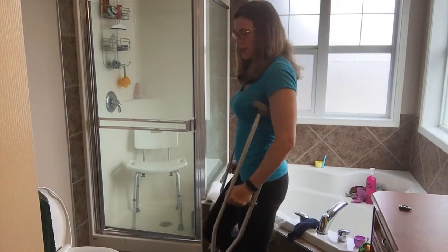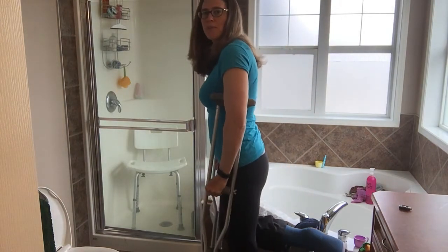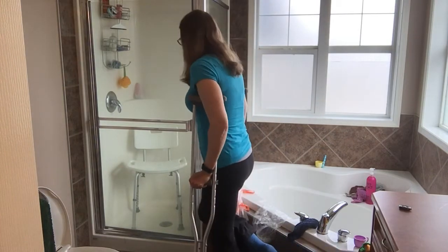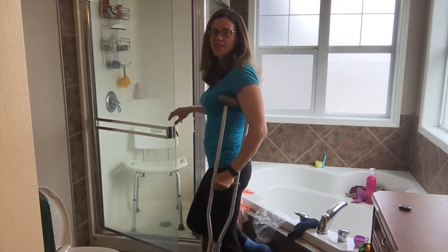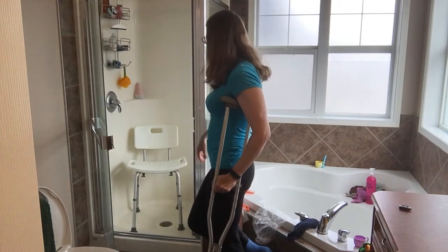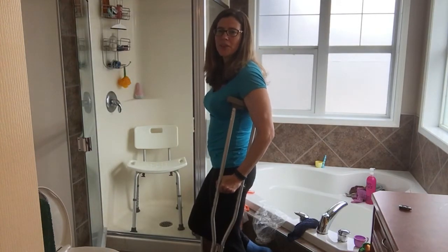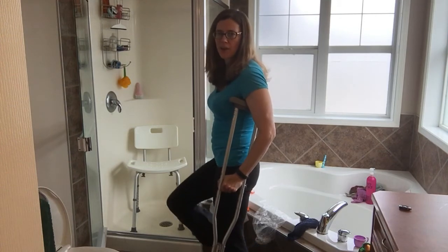I can't put any weight on my leg right now, so I hold it up behind me. I have a step into my shower, and you can also see I have a seat in here because it's just a lot harder to stand up the entire time showering on one leg.